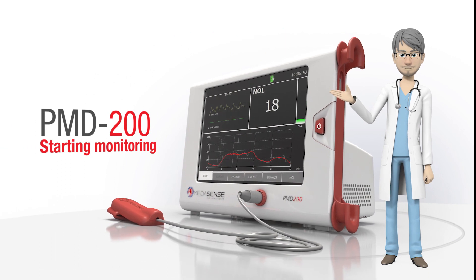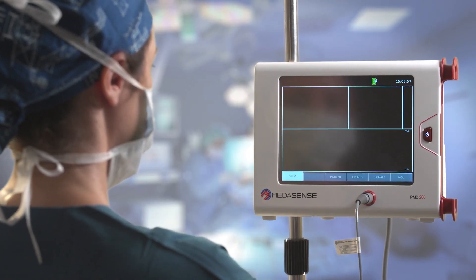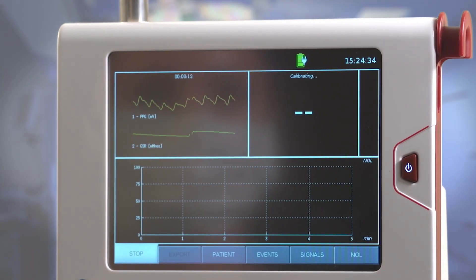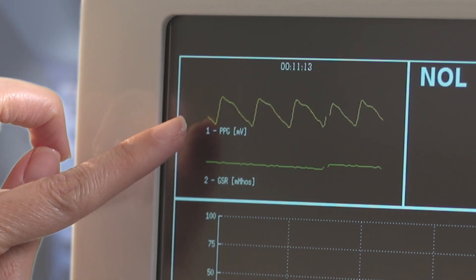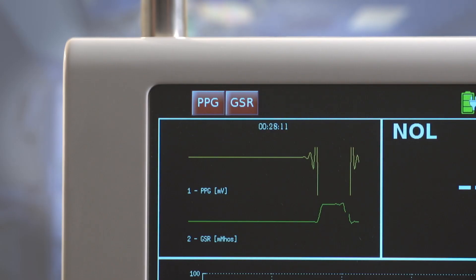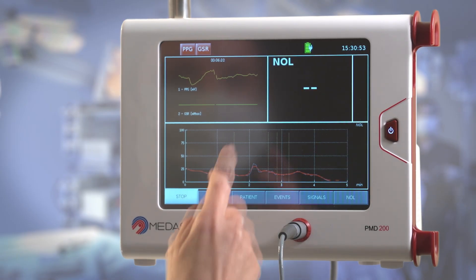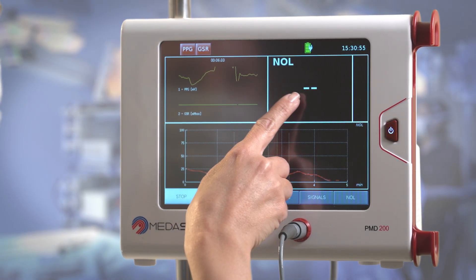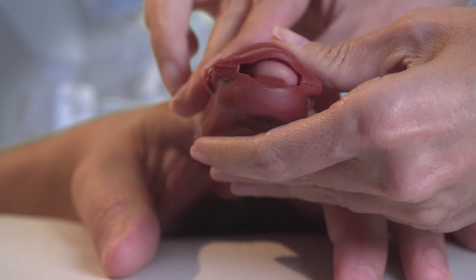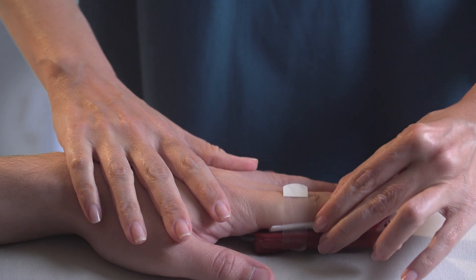Starting the monitoring session. Following induction, press Start to initiate calibration. Make sure the PPG signal presents a solid cyclic formation. The NOL will appear within 30 seconds. If a warning indicator of any of the sensors is highlighted in red, the monitor is not obtaining the signals adequately. In this case, readjust the finger probe contact with the patient's finger.